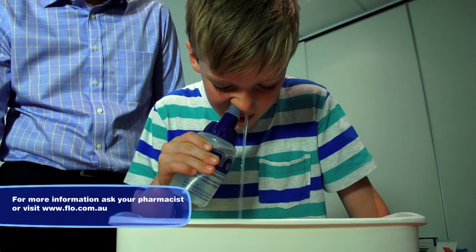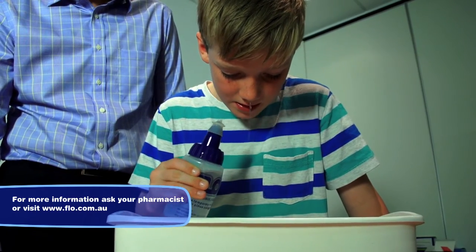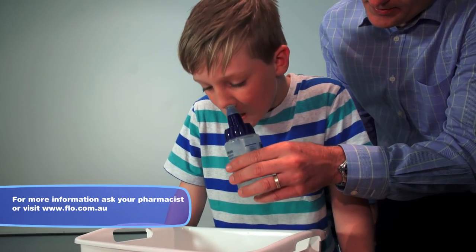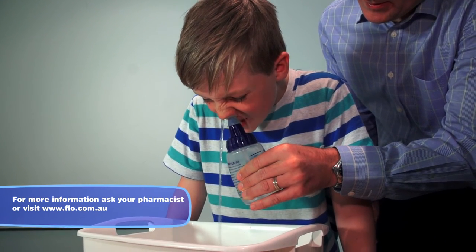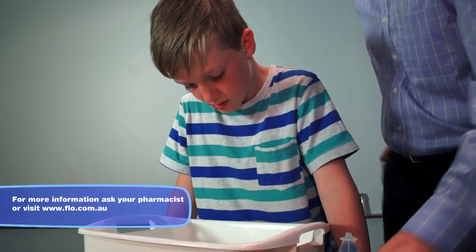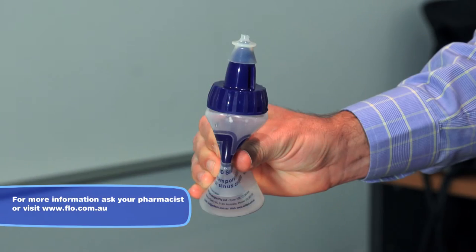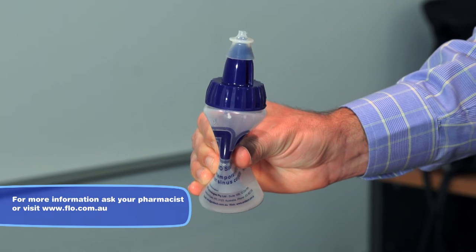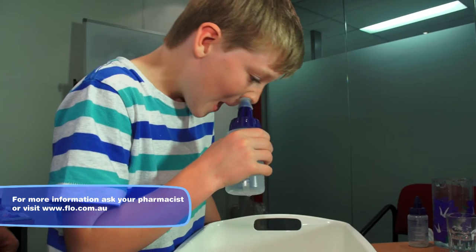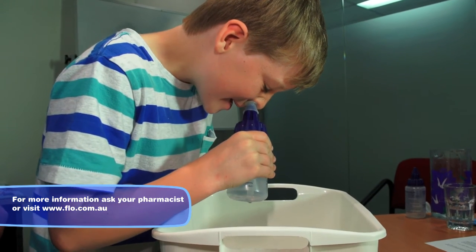When the child is panting, gently but firmly squeeze the bottle until about half the solution has been used. Many children are able to do this for themselves; however, if parental help is required, position yourself so that you are able to help your child gently squeeze the bottle. Whilst maintaining pressure on the bottle, withdraw it from the nostril and relax your grip, allowing the bottle to fill with air. Repeat the procedure in the opposite nostril.